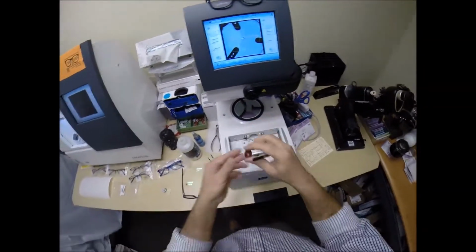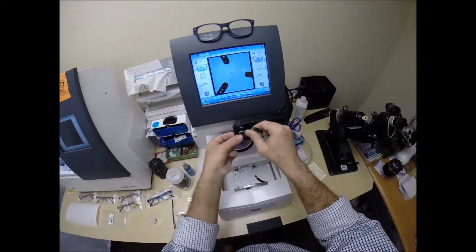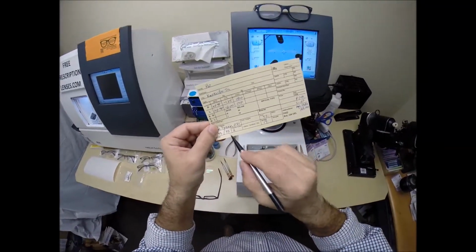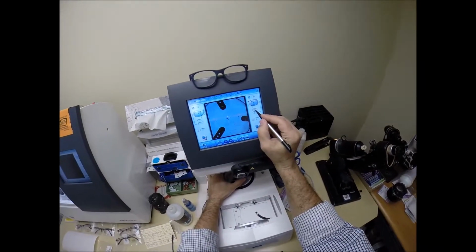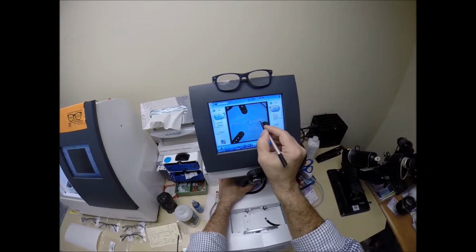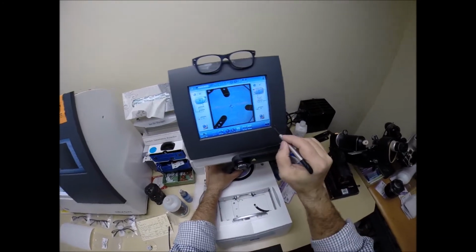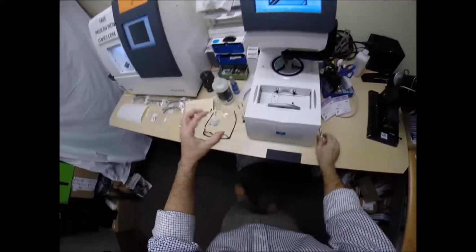We're going to do the same thing now for the left lens. We're going to pull the paper away to make the black side sticky. Line up the magnet. Grab your left lens. Now your pupillary distance for your left lens is also 33, so I don't have to change anything there. The optical center height stays the same. I'm going to line up those 3 dots. And this one right here, the optical center, is going to sit directly in front of your pupil. Hit that button, the arm comes down and places the block onto the left lens.